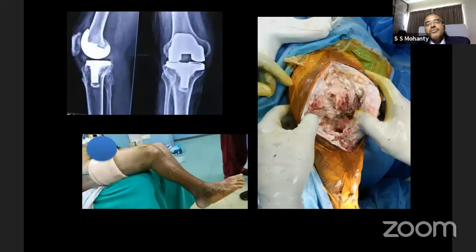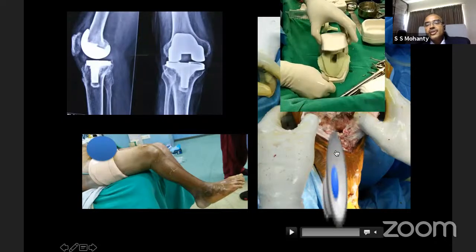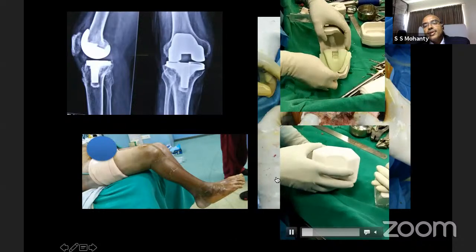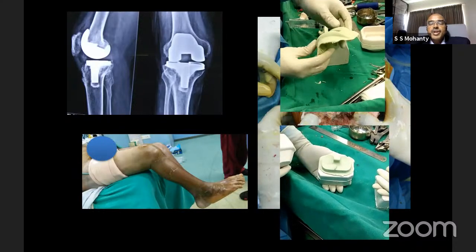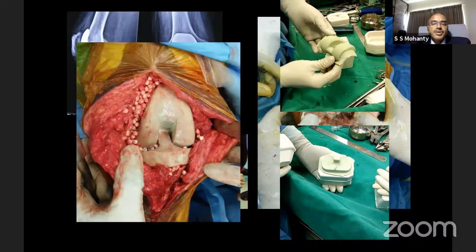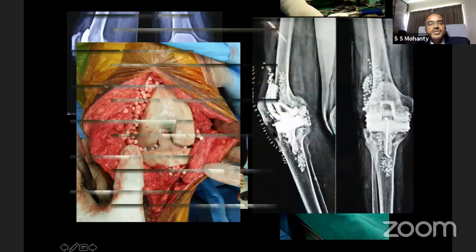Now, recently, again, we have prepared our own spacers using 100% medical grade silicone. They are polysiloxane, reusable, and autoclavable. So these are the spacers, with a couple of sizes available. Now it is not for commercial use, we are using it only internally. So this is the way you put the spacer. That is how our X-ray looks after putting the spacer there.